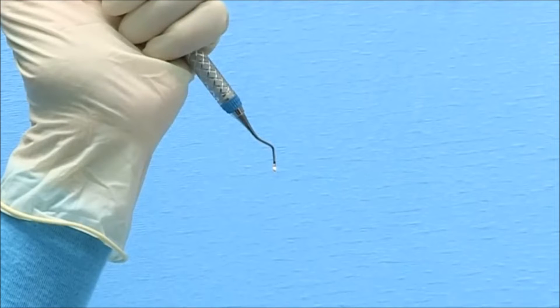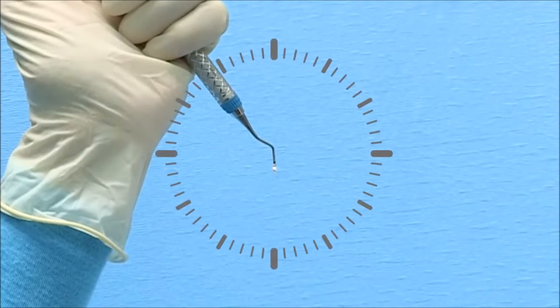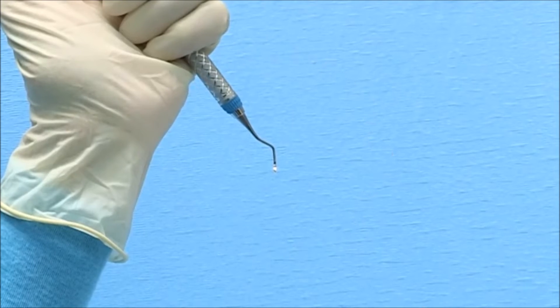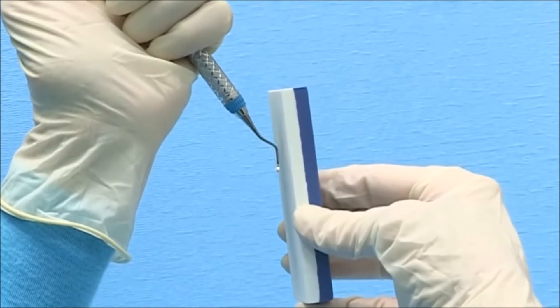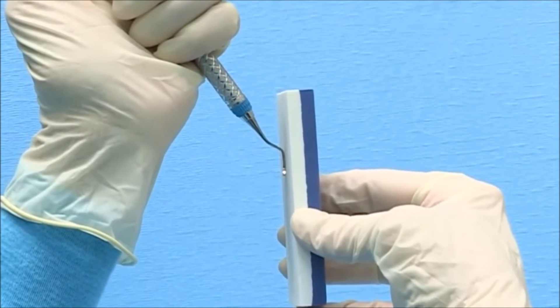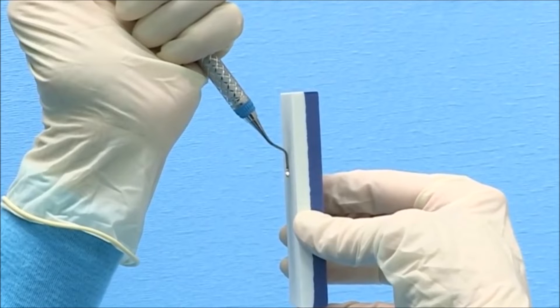Using the clock as a guide, hold the instrument vertically with the lower terminal shank positioned at 12 o'clock. Place the lubricated side of the stone against the right lateral surface of the blade. Initially place the stone at 12 o'clock.